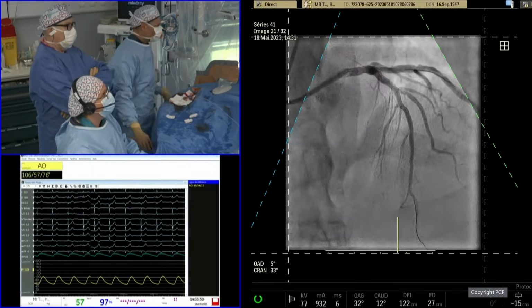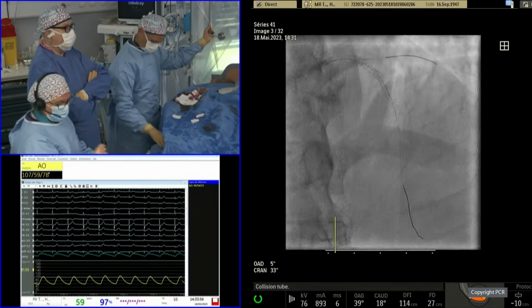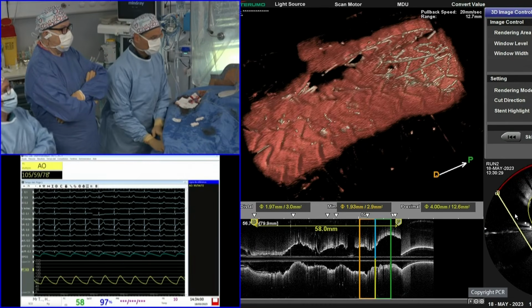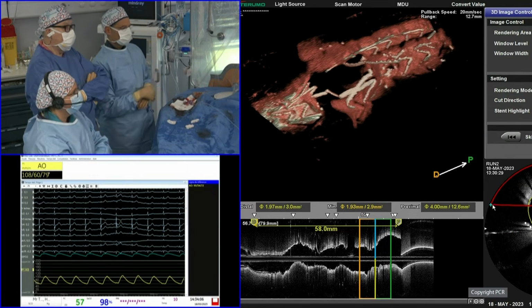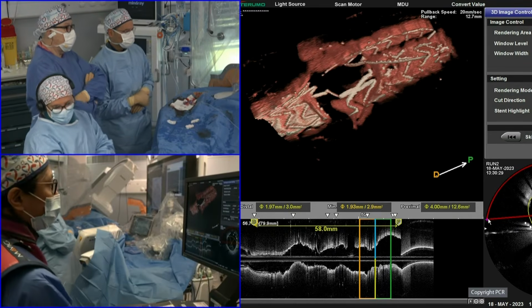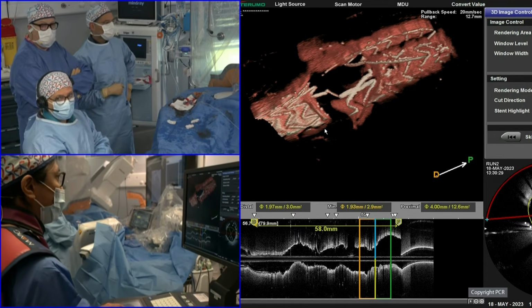Yes, I totally agree that historically this Kang's law applies 8 as a cutoff for the expansion of the left main. But considering the diameter of the left main was 4 millimeter, I think you need to really get to 11 or 12 square millimeter. If you really have a full expansion of 4 millimeter, it will be 12 square millimeter.